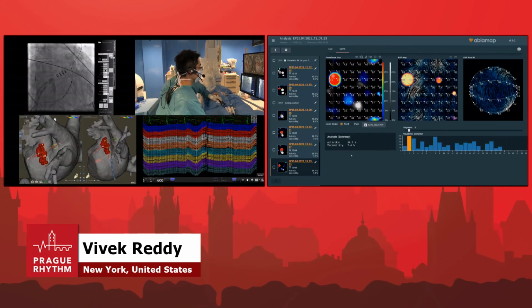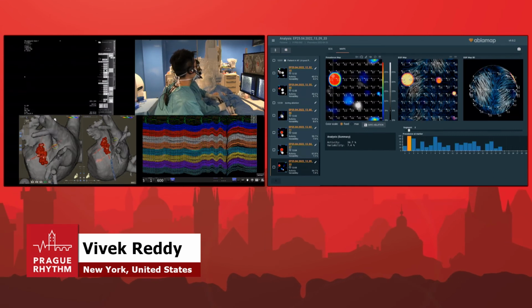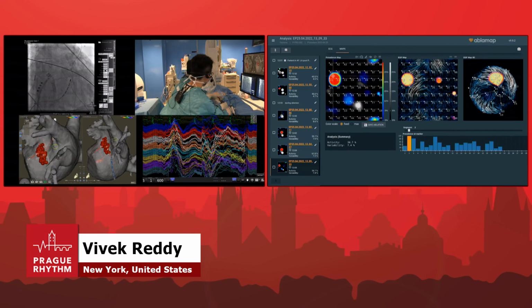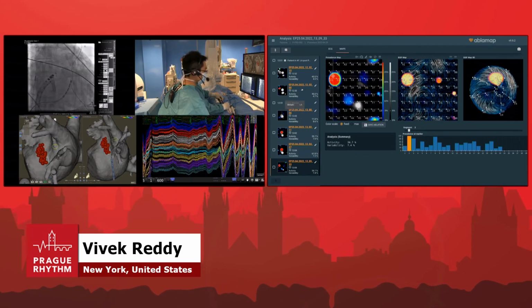Yeah, I think it was, we can look at it. One second, I'll show you. Let's take the basket back. You know what, let me do this first where I capture this like a snare or something. Okay, so can we show them?